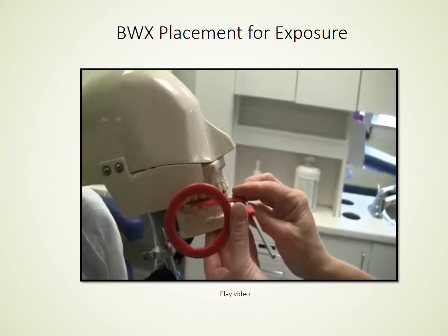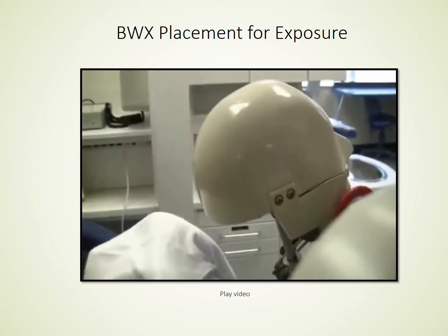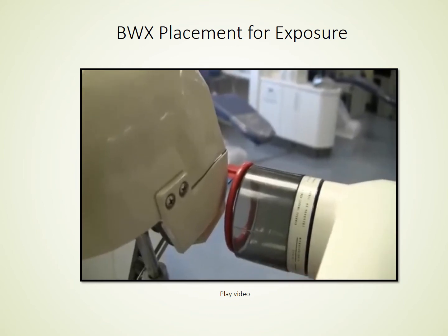and we're going to slide the ring in. Then again, we'll take our PID and line it up so that we're parallel with the ring and take the X-ray.